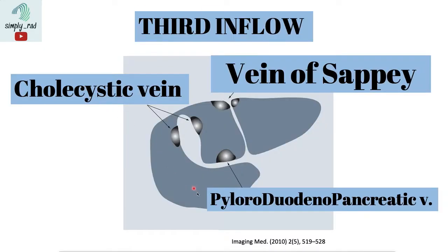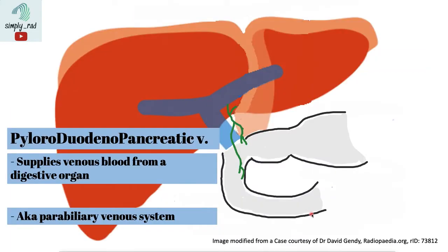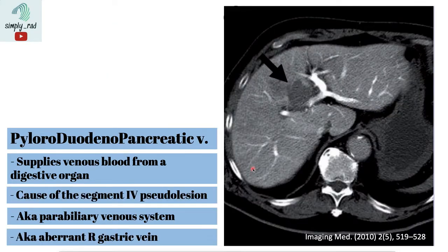Aside from the cholecystic vein, we also have the pyloroduodenal pancreatic vein. Because this vein courses in the region of the hepatoduodenal ligament, which also contains the common bile duct, it is part of the parabiliary venous system. This third inflow brings venous blood from the pylorus, duodenum, and pancreas, and causes potential hypo-enhancement in segment 4 — another typical area of third inflow pseudolesion.